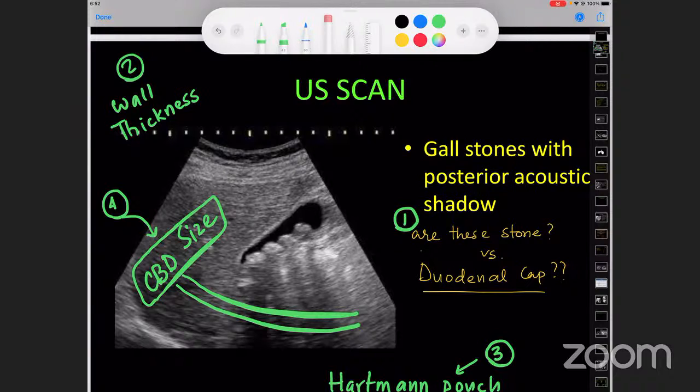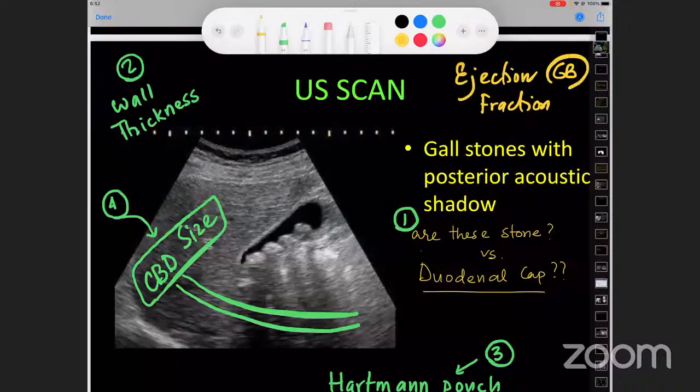That means, basically, we are coming to the concept of the ejection fraction of a gallbladder. Because in this question, what Dr. Bakshi asked was a very relevant question. If these are asymptomatic stones, the patient doesn't have any symptoms, did an ultrasound, say, for example, as an executive checkup, and that picked up, with normal wall thickness, these 4 stones. So can you say about the ejection fraction that happens?